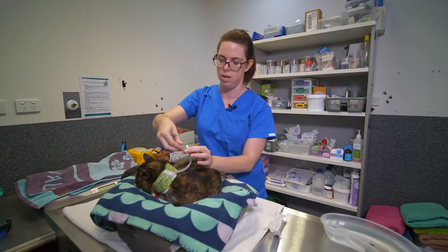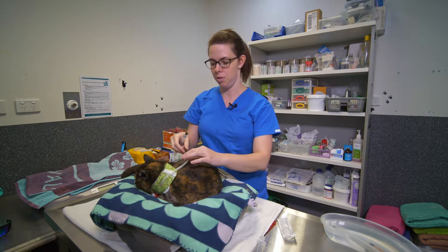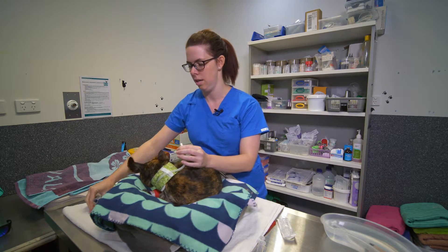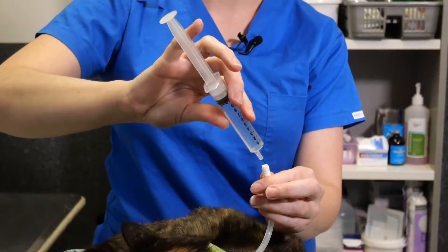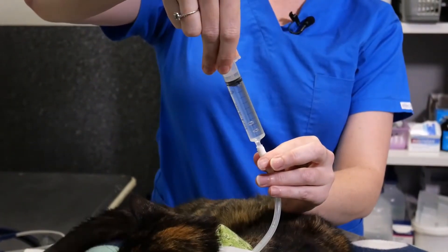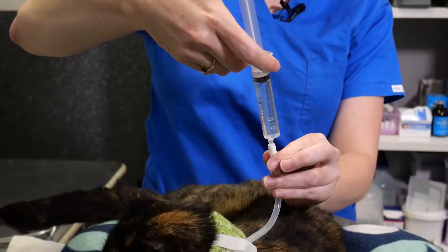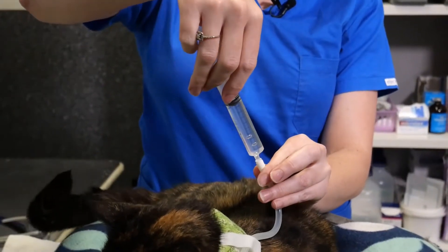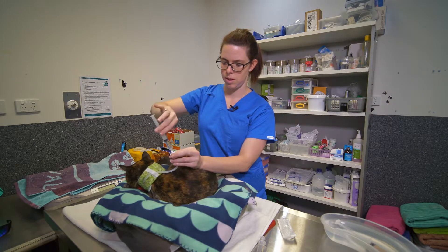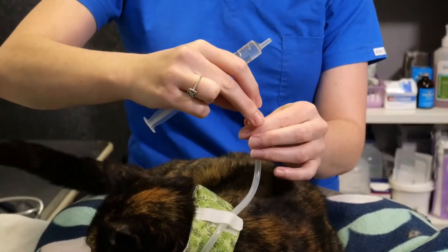If that happens, give the clinic a call. Once that's all good, the next thing to do is flush the O tube — this also helps check for positioning. Take the cap off again, and slowly put down about five mils of plain water. Watch for any signs of coughing, gagging, or retching. If any of those occur, stop, put the cap back on, and give the clinic a call. As you can see, Missy didn't have any reaction.